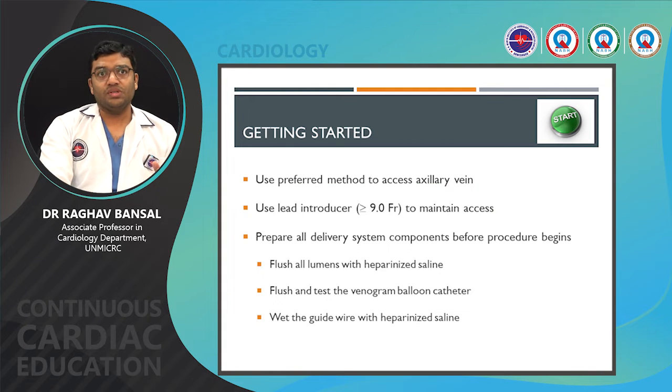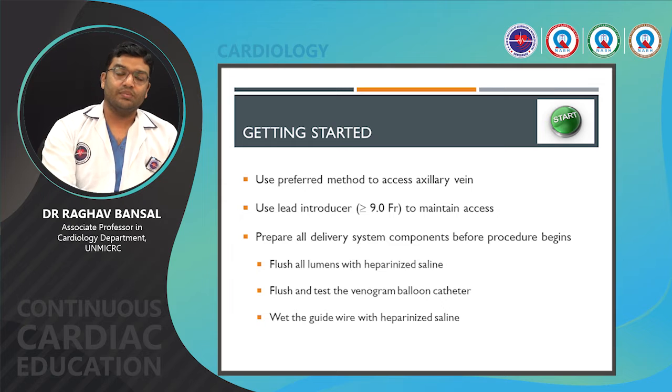Now, starting with the procedure, we all know about implanting the dual chamber pacemaker, I at least hope so. So I'm not going into those details, and you know about how to set up the trolley and everything. So I'm not going into those details.